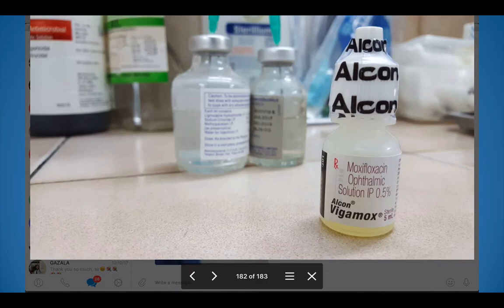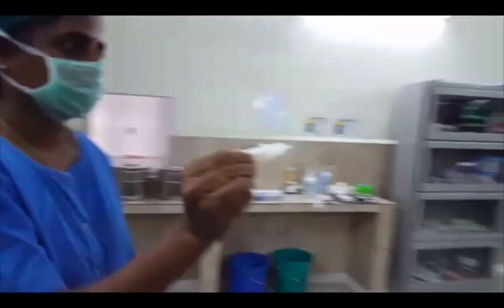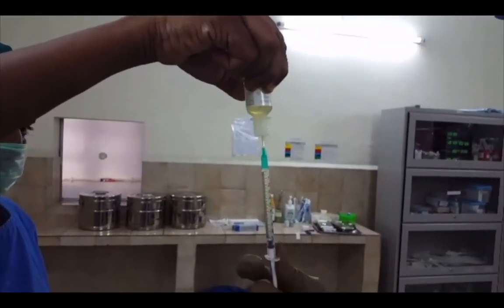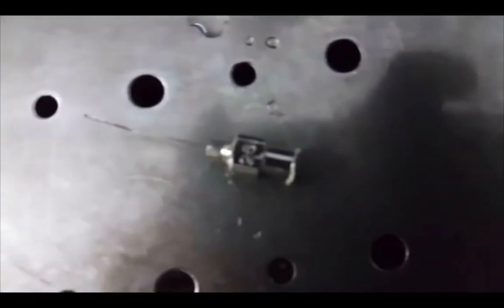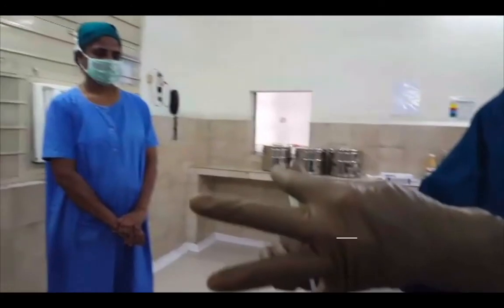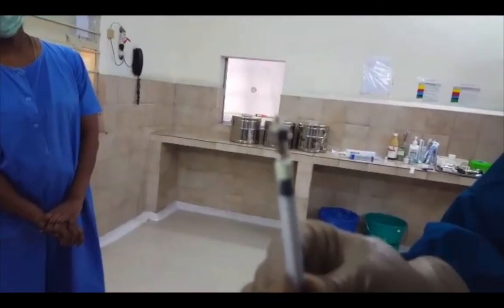This is the way we normally prepare intracameral moxifloxacin. The circulating nurse opens a fresh bottle of Alcon Vigamox taking care not to touch the tip. The assisting nurse uses a 1ml syringe and withdraws close to 1ml from that bottle, then changes the needle for a 26-gauge cannula. I prefer to reuse the same cannula used earlier in surgery for hydrodissection and power wash, confirming it is free of particles. She then vents most of the moxifloxacin until 0.1ml remains, and this 0.1ml of undiluted moxifloxacin is injected via the side port into the anterior chamber after stromal hydration.